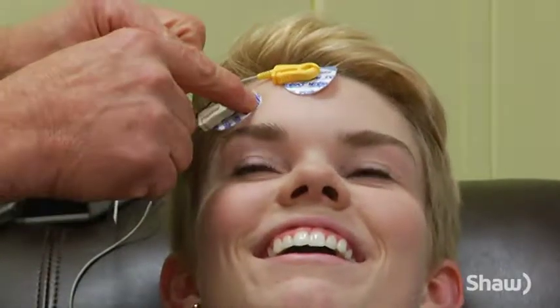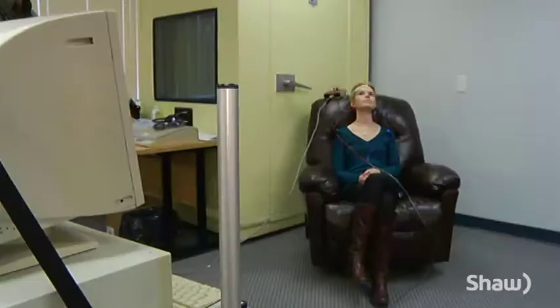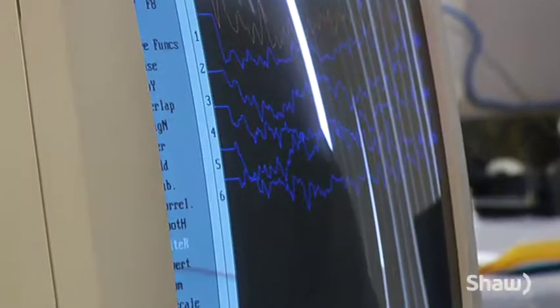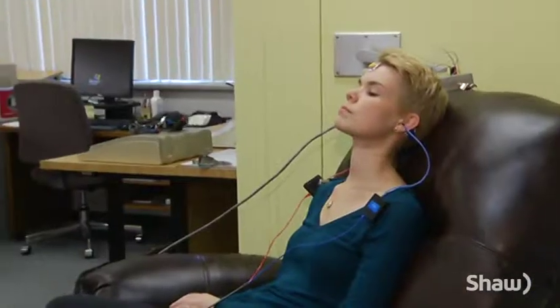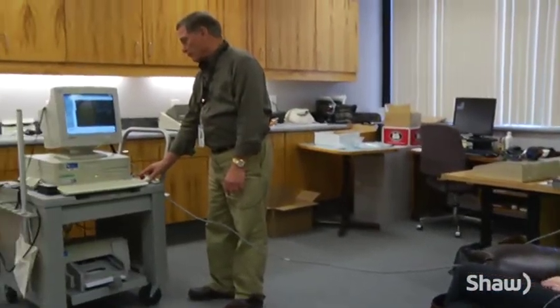Using electrodes on the face and behind the ears, an audiologist can send a signal into the ear, up the brainstem, and then graphically measure any disconnects along the way. It can be done on adults with potential workplace injuries, aging adults, or newborns who failed the initial hearing test.